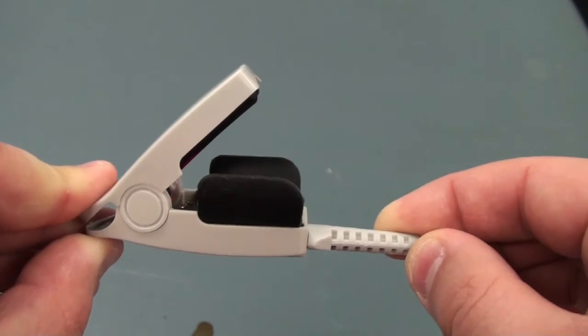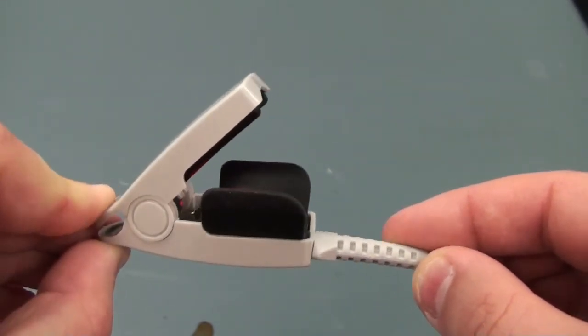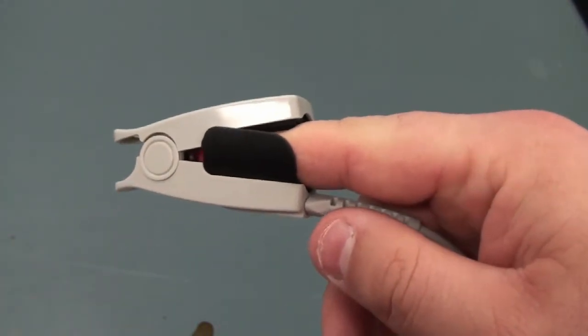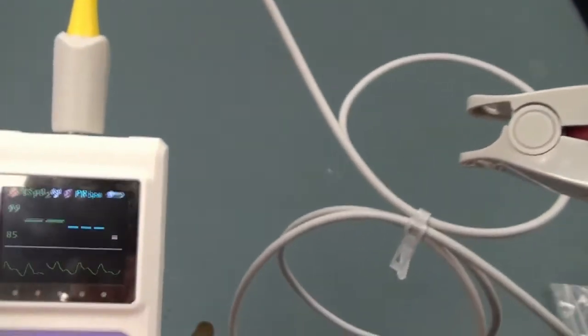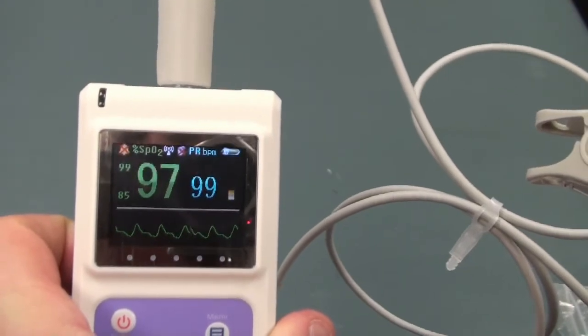When using the device, be sure that nothing is obstructing the light. Simply place your finger inside the probe and let the device clamp down. Once your finger is in the device, you'll start to notice that the device is starting to take the measurements.